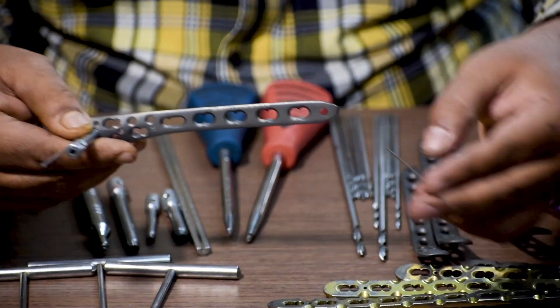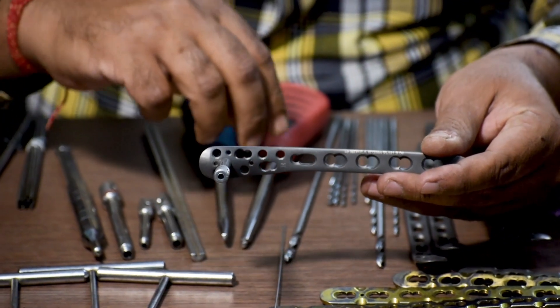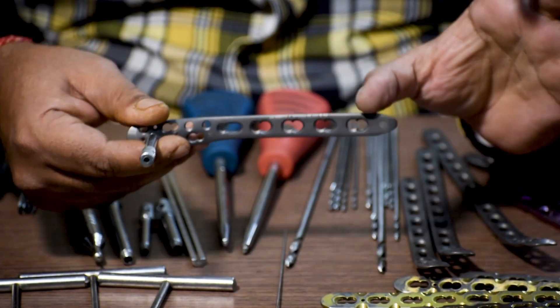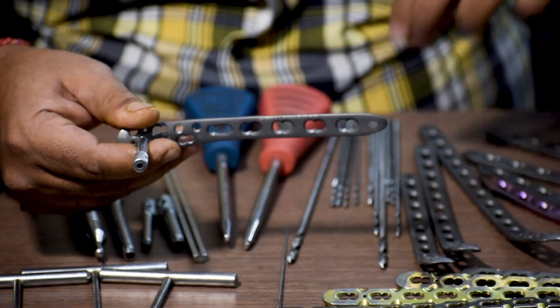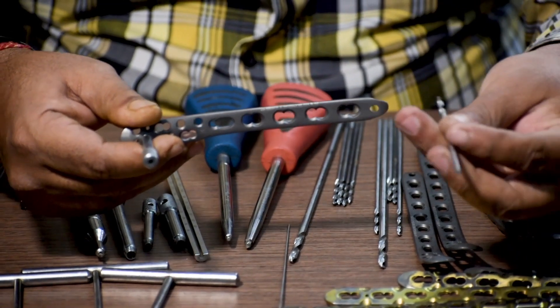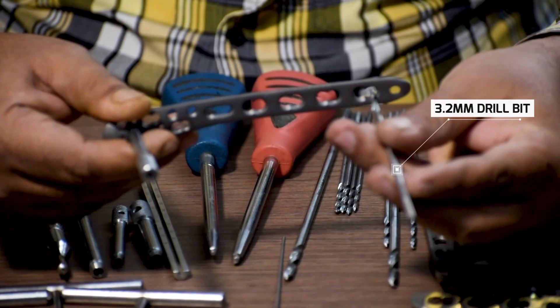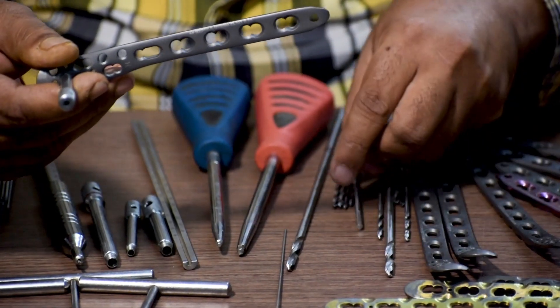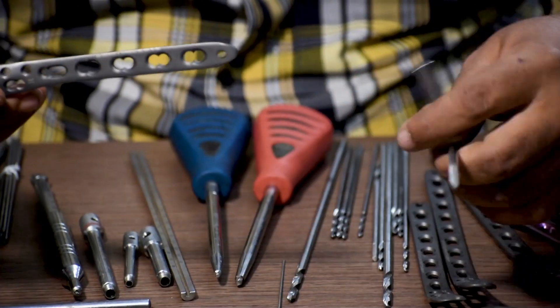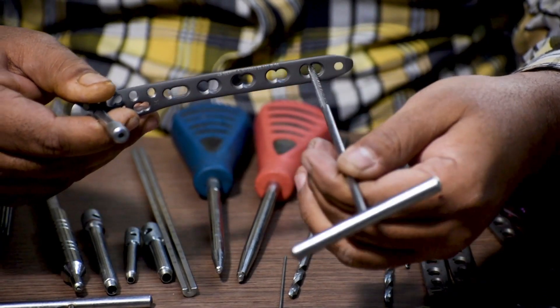Now, in order to fix the screws for this plate, various sizes of drill bits will be used. For the shaft part of this plate, it is a 4.5 system. A 3.2 mm drill bit is used to drill through the non-locking hole to fix a non-locking screw in the shaft region. After drilling through the non-locking hole, if required, tap with a 4.5 mm bone tap for clear entry of the screw.